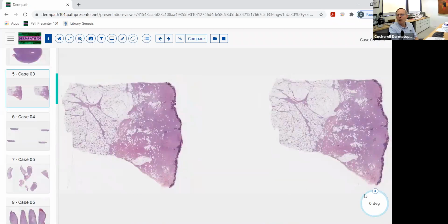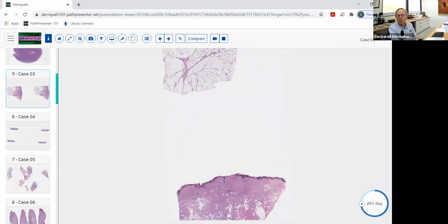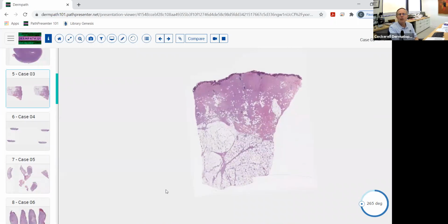Now, just to mention a couple of other types of dermatofibromas, there's a dermatofibroma with monster cells. We get these very large cells that are probably histiocytes, and they're multinucleated, and they can look kind of bizarre and almost look like malignant in some ways, but they're not really malignant. There's a type that can have a lot of osteoclast-like giant cells. There's a type that can have a lot of lipid in them that can almost look like a xanthoma.